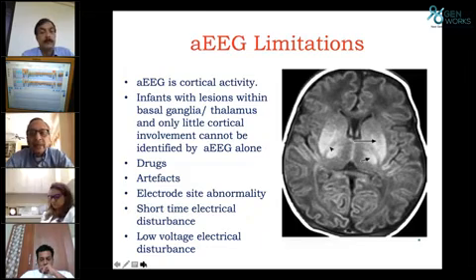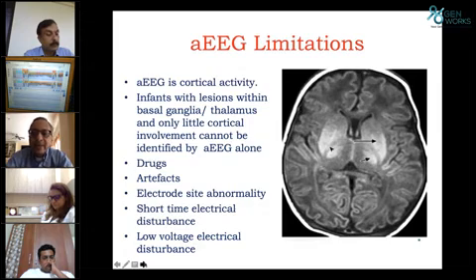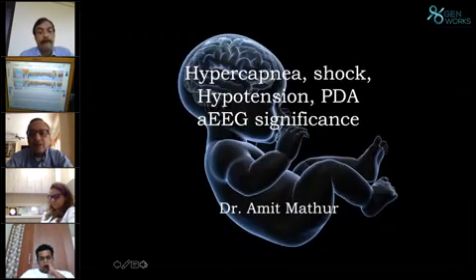The other thing to remember is, of course, if you have a frontal seizure or an occipital seizure or seizure elsewhere in the brain, so if you have a temporal lobe origin seizure, which are all overall less common, you're likely to miss those if you just use the C3P3 and C4P4 channel.